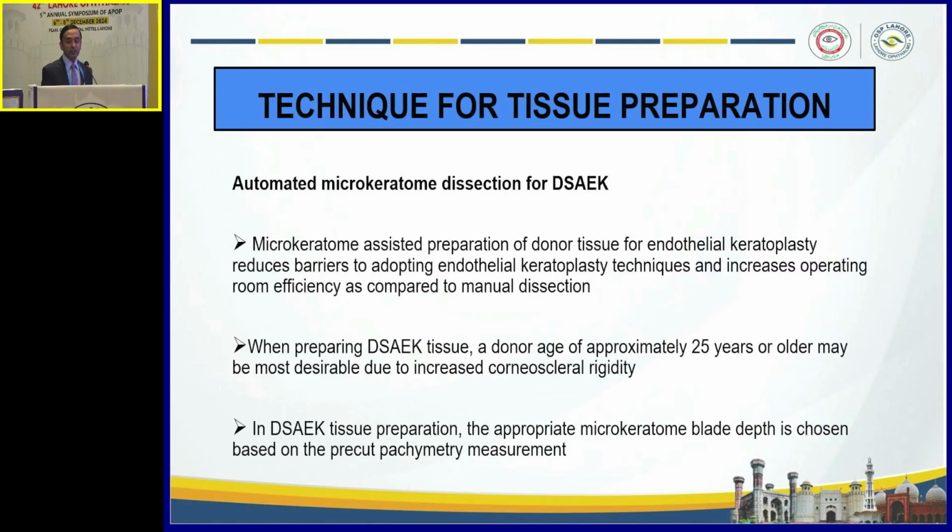Technique for tissue preparation. Mainly when preparing DSAEK tissue, a donor age of approximately 25 years or more may be most desirable due to increased corneal rigidity.